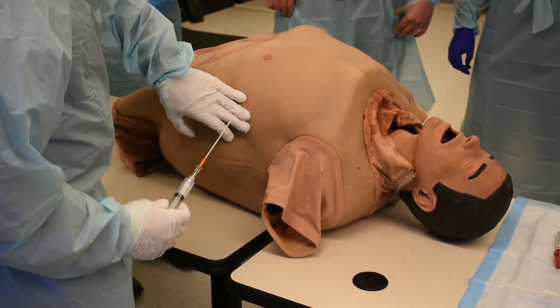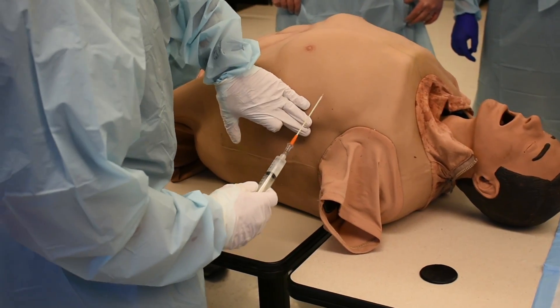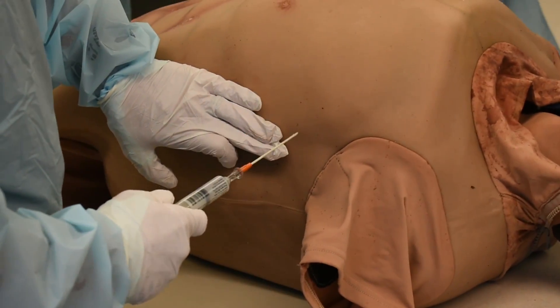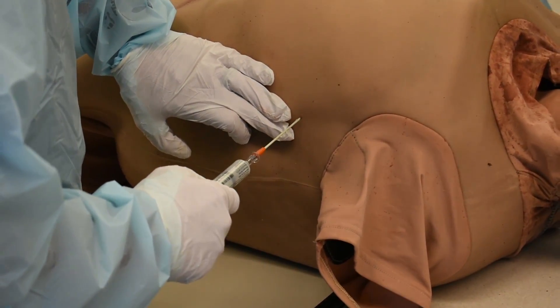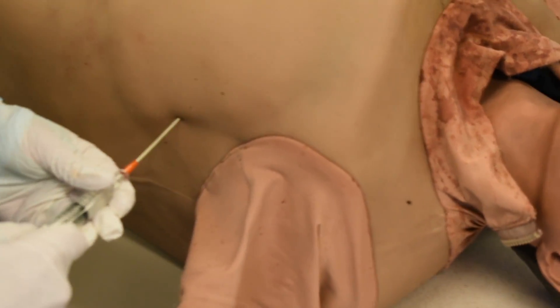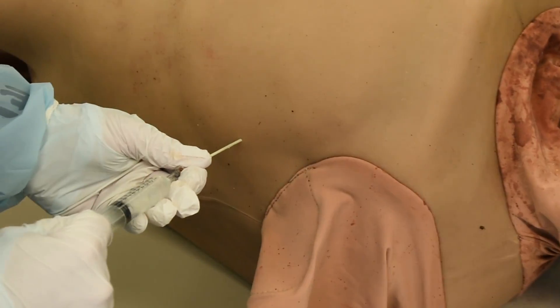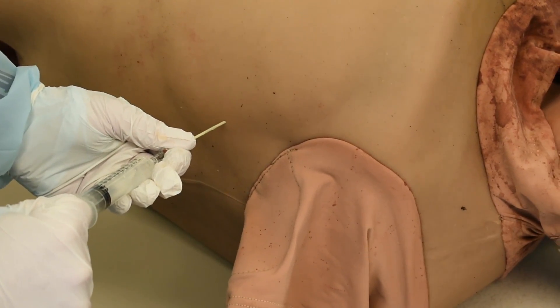I find his fourth or fifth intercostal space, find the rib right here. I'm going to pull down and do everything the same way — bevel up, because I like to do the same thing every time. Let go of his skin. I put it through his chest, and as I go into the space, I get that nice big rush of air. Boom. I'm done.